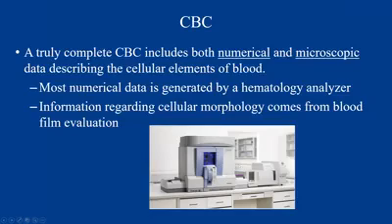This is actually, if you haven't seen these, like the size of some of our reference level analyzers. So they're quite big. The little in-clinic analyzers are maybe this big for size comparison. So even these massive, really expensive, heavy things can't do everything that we need them to do.